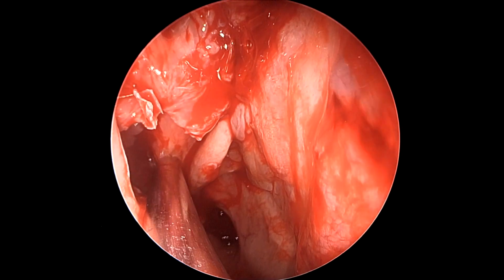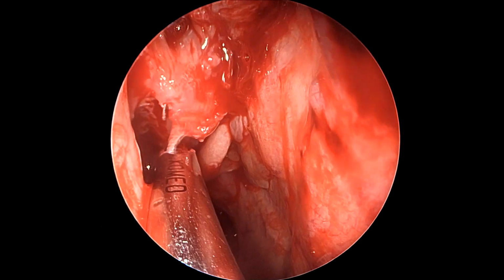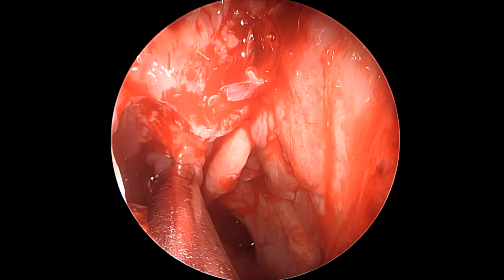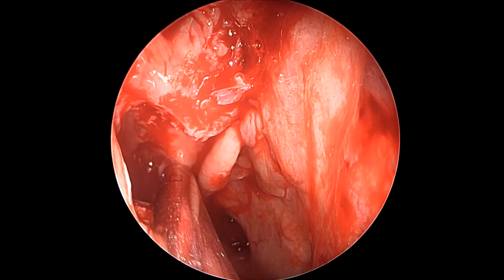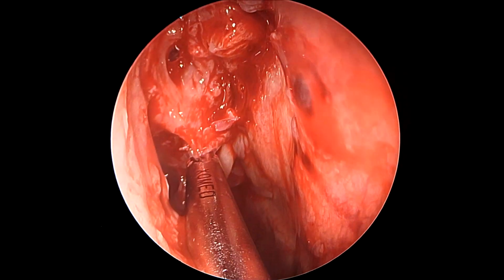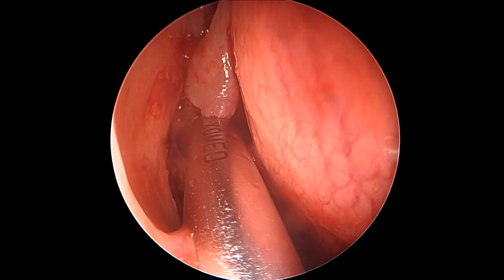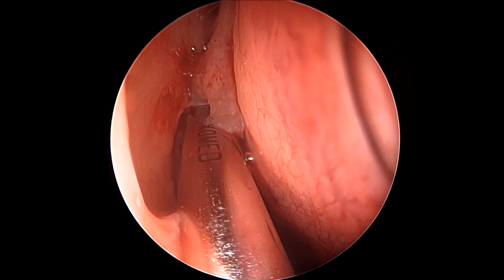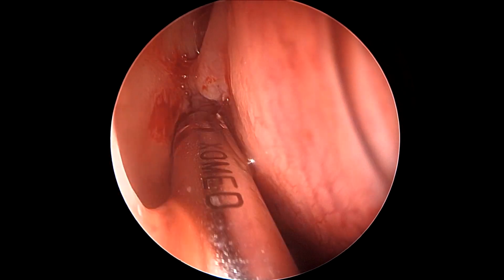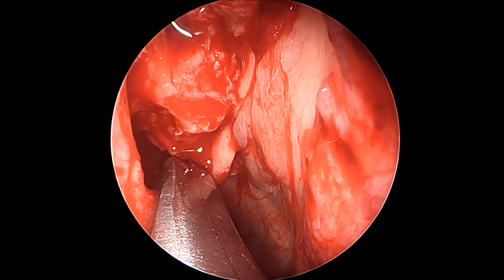As we see here, we are still debriding and debulking some of the polyps that fill the middle meatus to overall gain space inside the middle meatus. We can start seeing the tail of the middle turbinate already medially and the maxillary antrum laterally. The small polyp seems to be coming from superior, and the way it is coming medially, it appears to be coming from the interfrontal sinus septal cell, which was first seen in the CT scan.